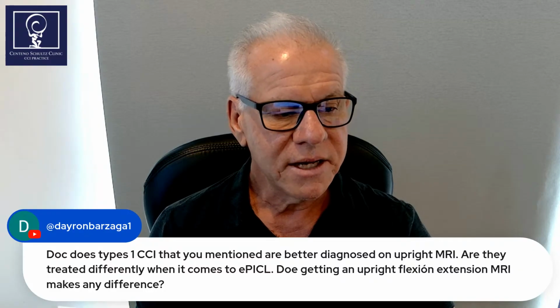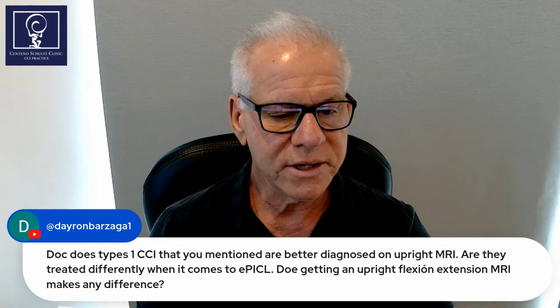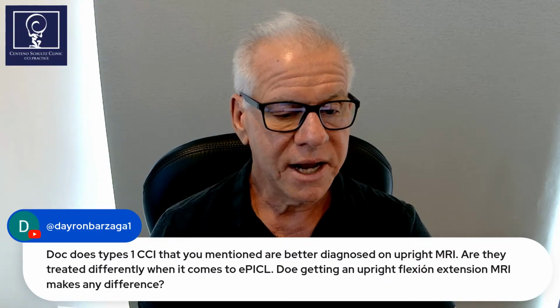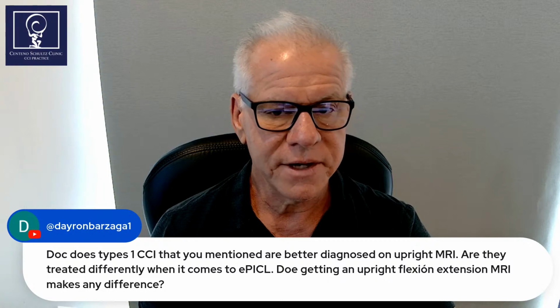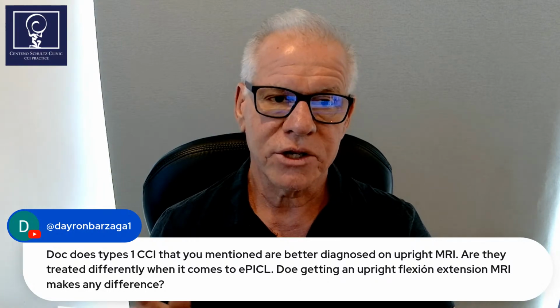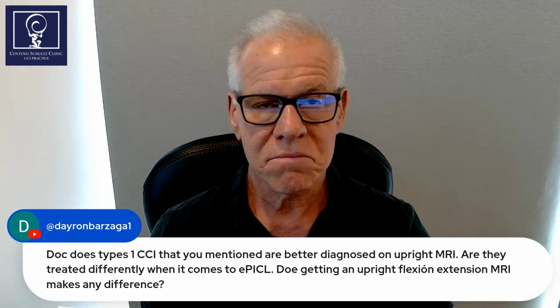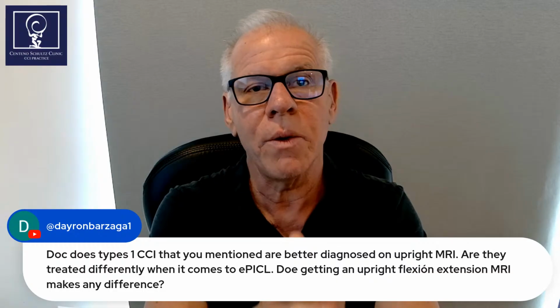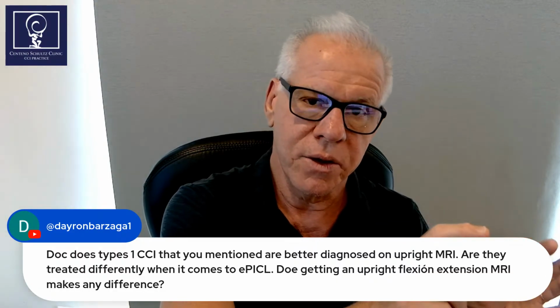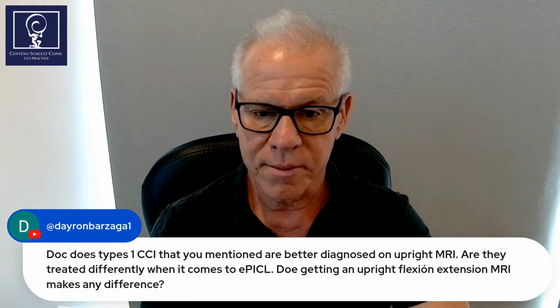Doc, do type 1 CCI that you mentioned get better diagnosed with an upright MRI? Are they treated differently when it comes to EPICL? Does getting an upright flexion extension MRI make any difference? Yeah, realize that many of the structures that we're going to treat anyway at C0, C1 are really going to be done based on your clinical history, not necessarily an upright MRI.